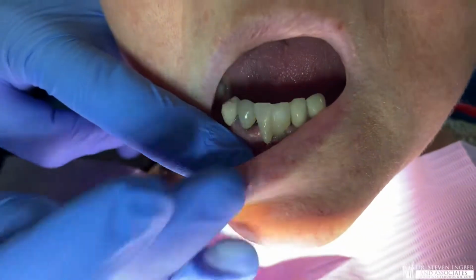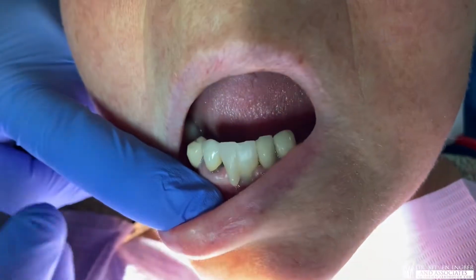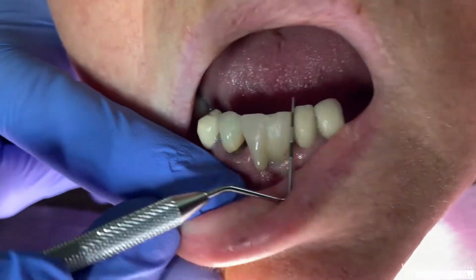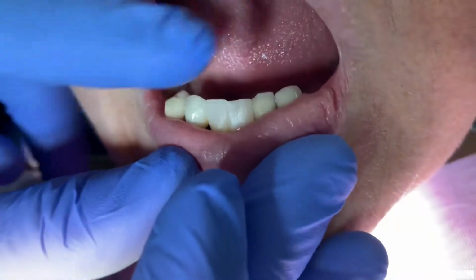Let's go back to the prosthetics here. So here's 2 teeth. This is zirconia from Germany. My lab guy says this is the best in the world.